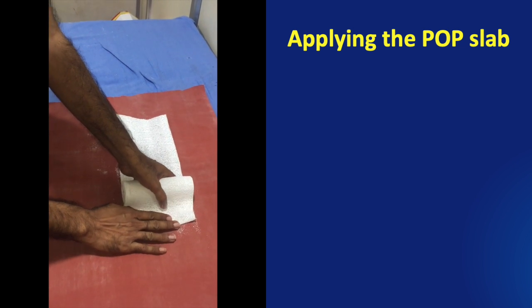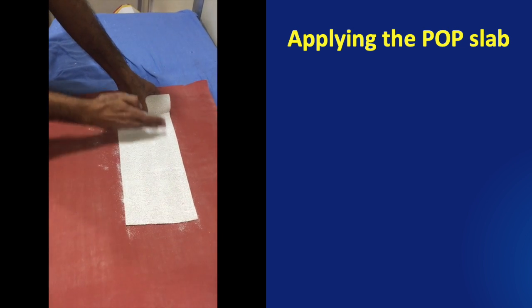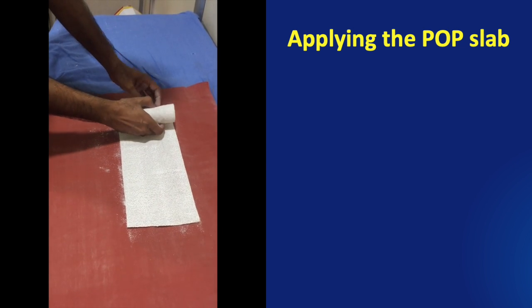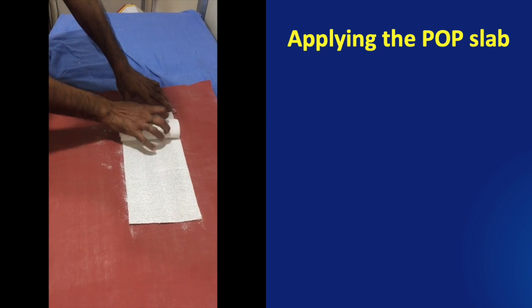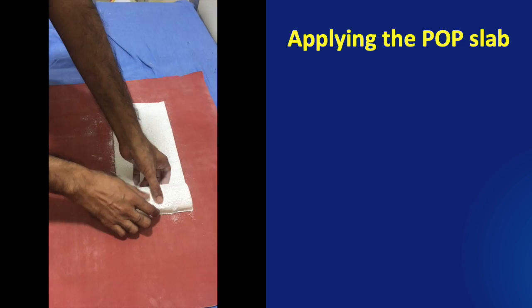We now pile up the layers of POP one by one over each other for the required length and the required number of layers. Usually we use about 14 to 16 layers.